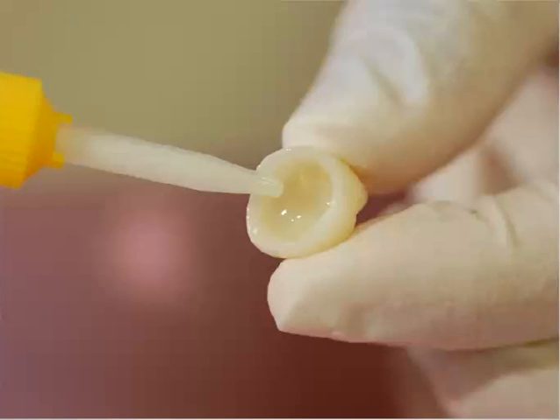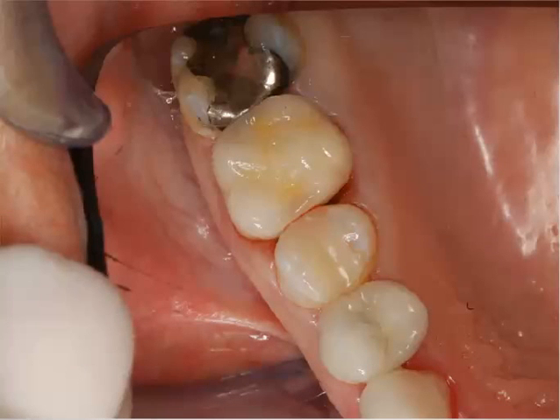But we're going to go ahead and place this in the crown. Now, if it's a core-based crown like zirconia, you do not silanate it. That's only for etched ceramics like Emax where they're pressed or milled. We're going to go ahead and layer this in. You don't need to fill this up to the top. You simply want to layer this in. It's only like 20-25 micron film thickness.